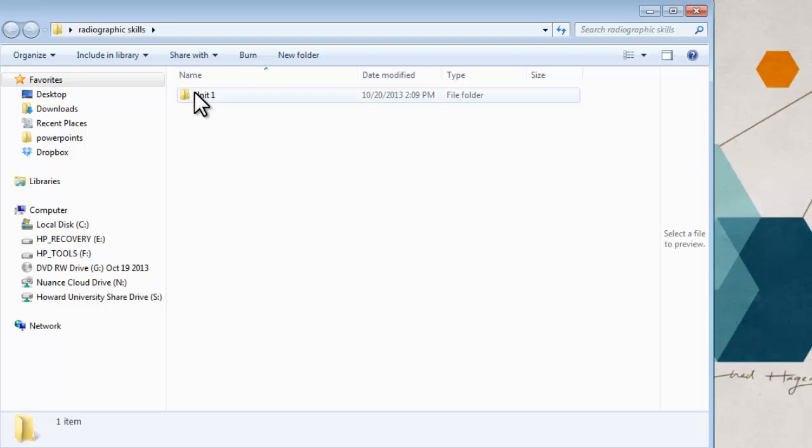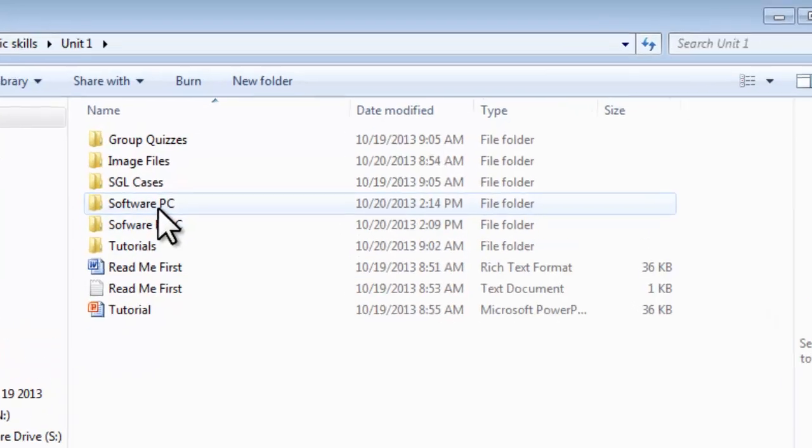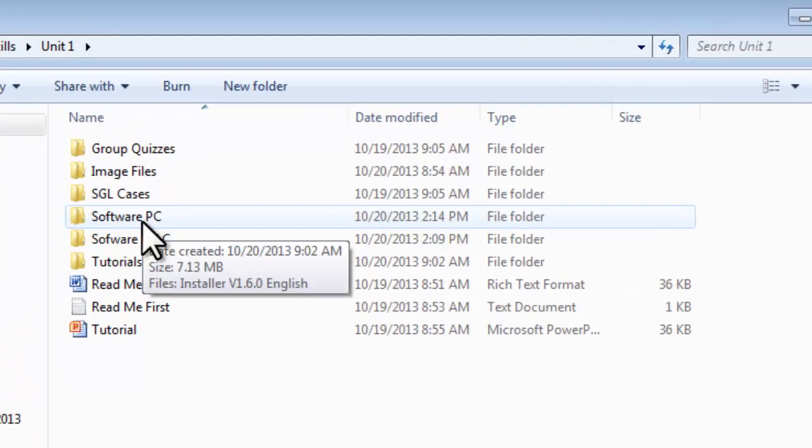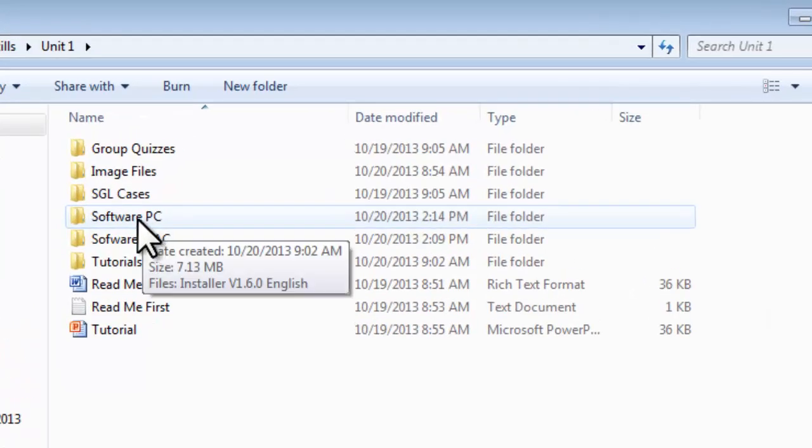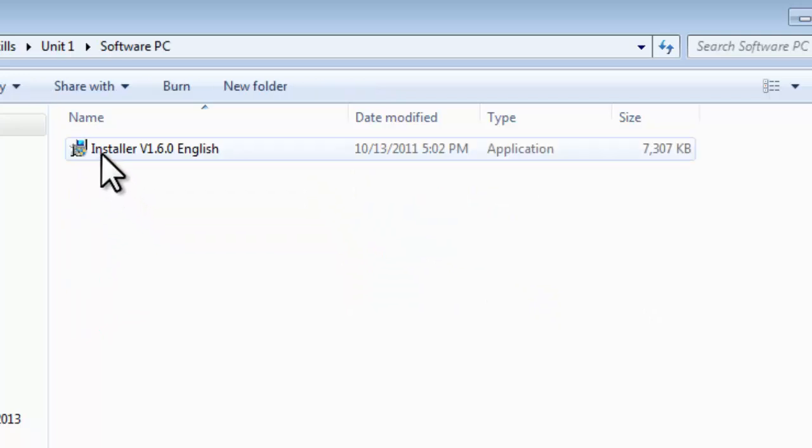Then we open up Unit 1 by double clicking. Then we go to the folder that says Software PC. We double click that, and there is the installer for K-Pax.